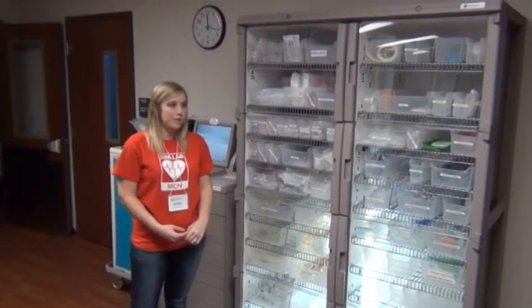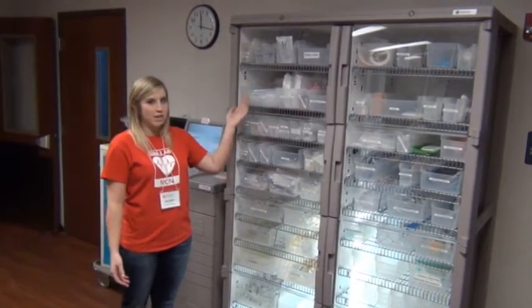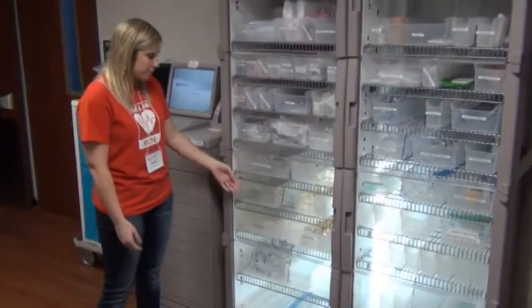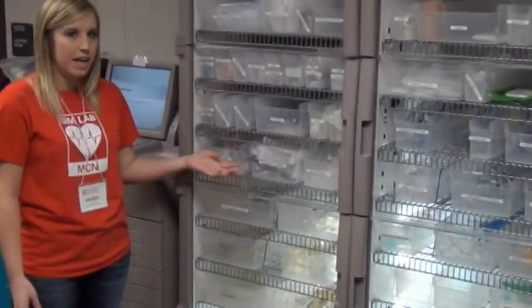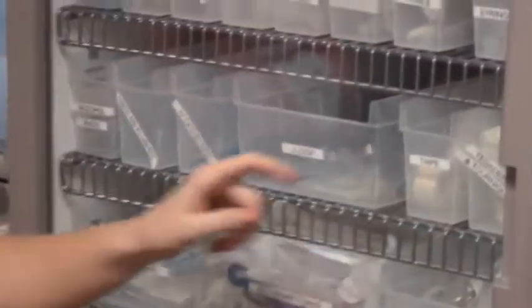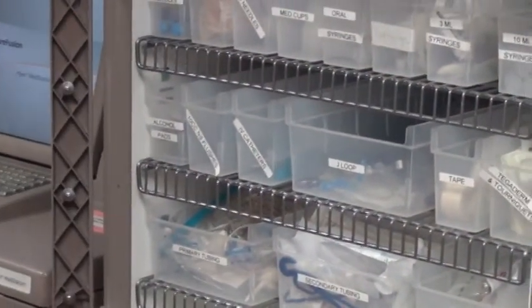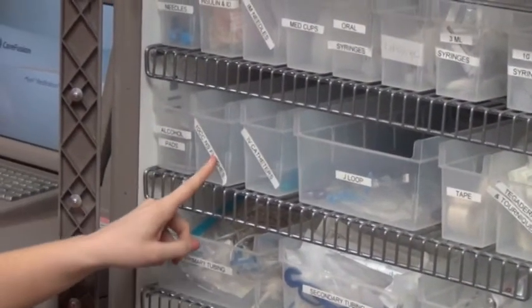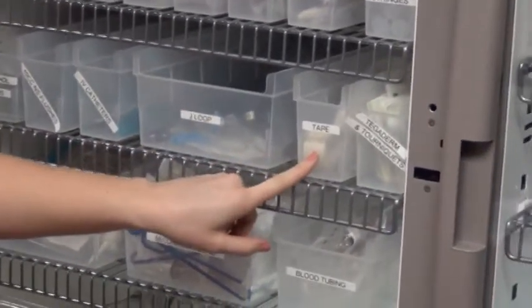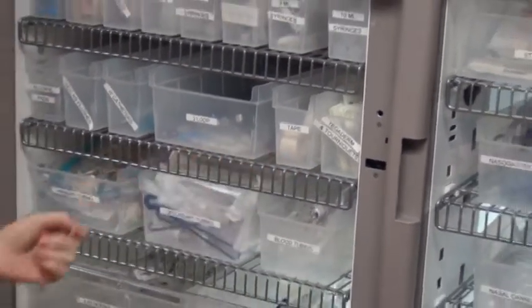If your scenario calls for any supplies, this is where you'll get them. Up here we have all of the Foley catheter kits that you may need. Down here we have IV fluids. Here we have our primary and secondary tubing that you'll use. And then along here we have all of our supplies to start an IV. You'll have your alcohol pads, your flushes, IV catheters, the J-loop, tape, the Tegaderm, and the tourniquets located here. So this is all that you'll need to start an IV.